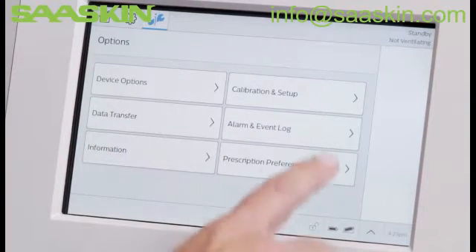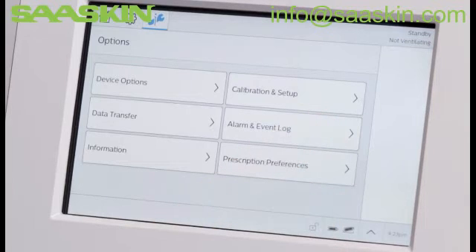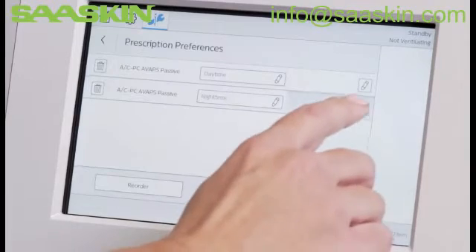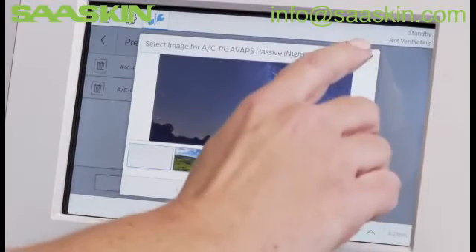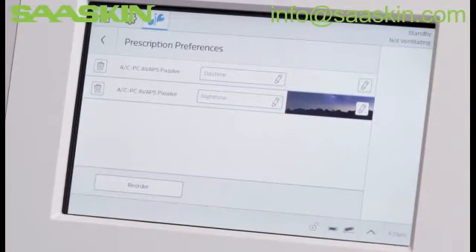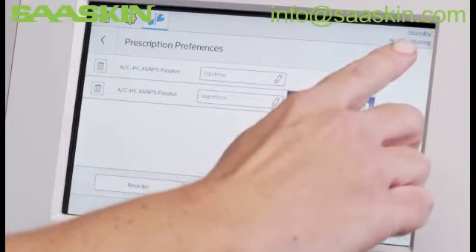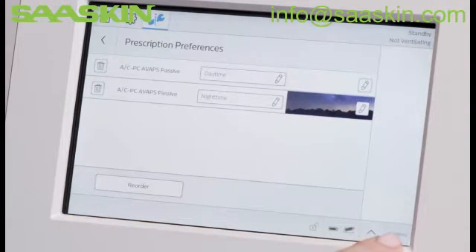Below that option is Alarm and Event Log. In Prescription Preferences, you can delete or edit the prescription names and background images. In the top right corner, you can see the current prescription being used, or in this case, standby. At the bottom of the window, you will find the time and an arrow with the menu for Touchscreen Log.